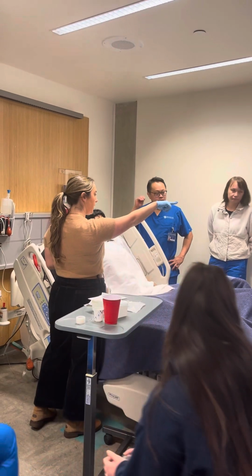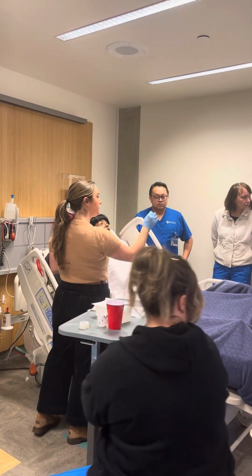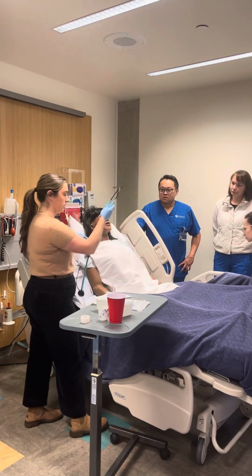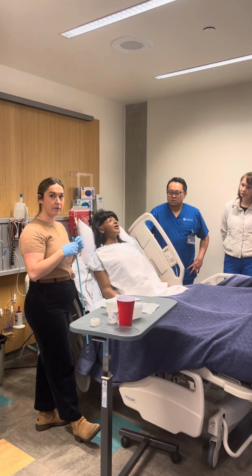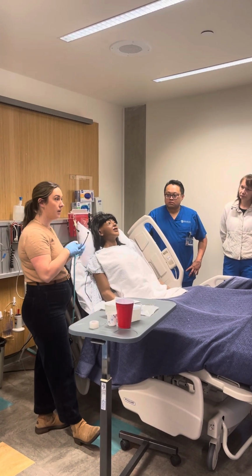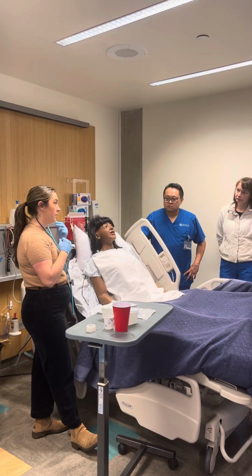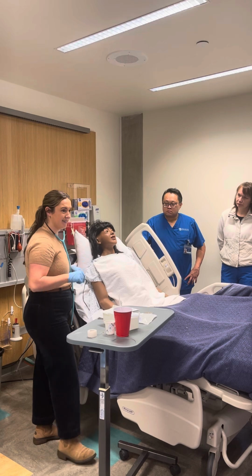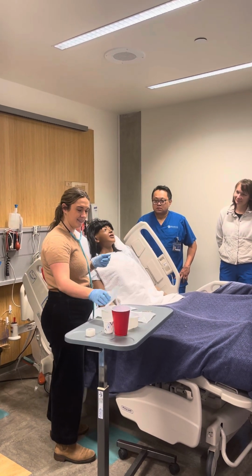Will you throw me a stethoscope as well, please? So I tend to, you don't need to do this part for your video. This is what I do in practice. I tend to hook my one thing here so that I can just go like this when I'm ready to check for air. Smart. Yeah.